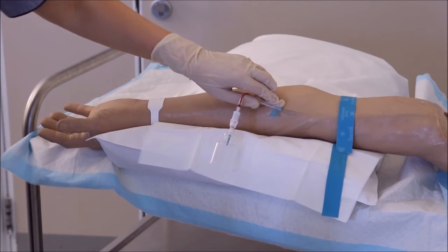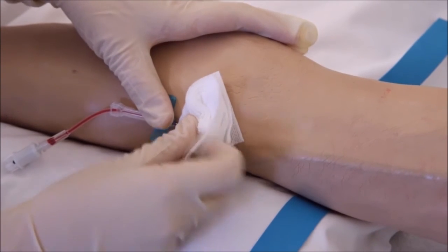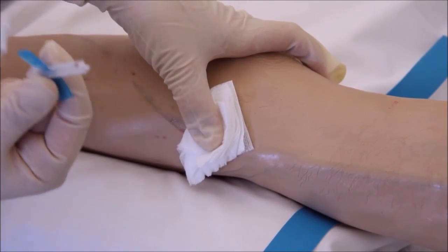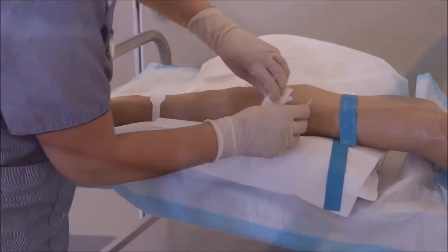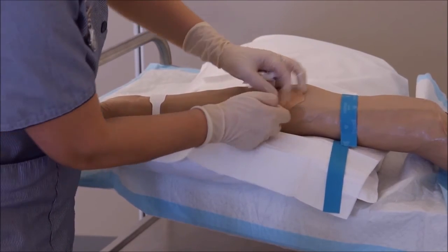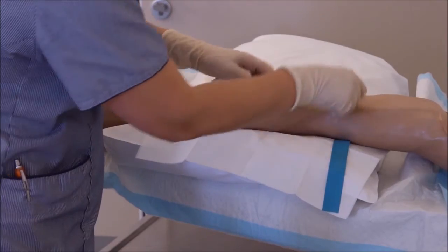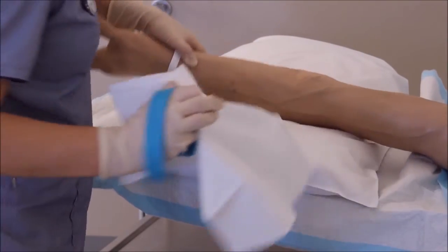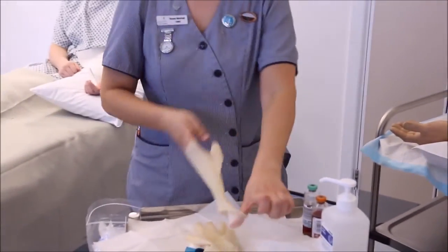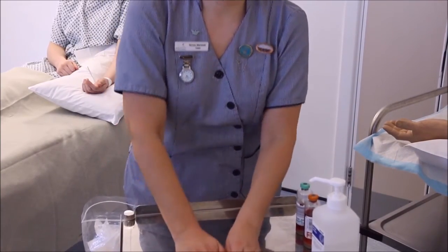Release the tourniquet. Release the tape. Place sterile gauze swab across insertion site. Remove the butterfly needle and engage the safety feature. Safely dispose of sharps. Remove the gloves, decontaminate hands and apply clean gloves.